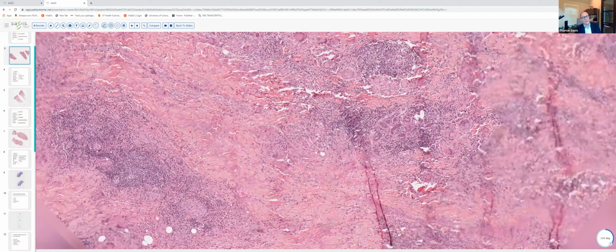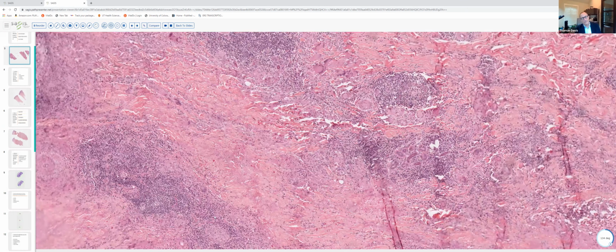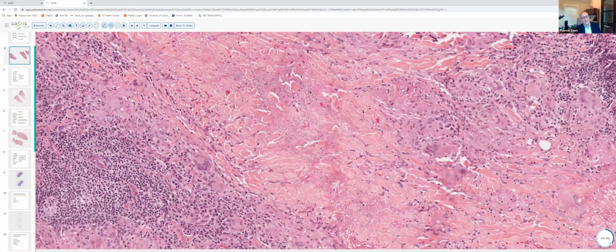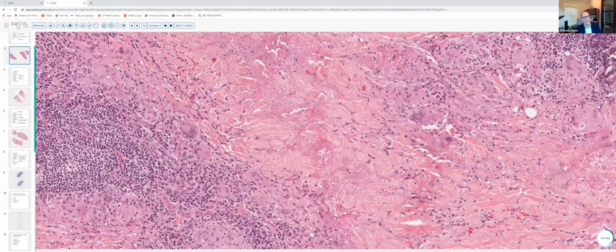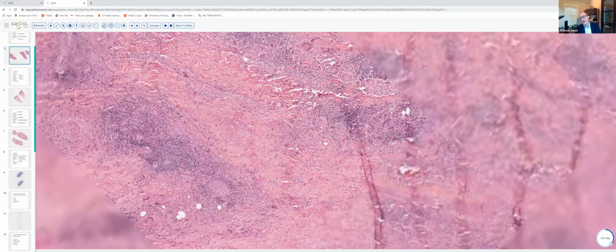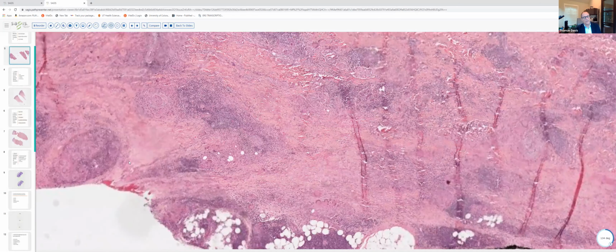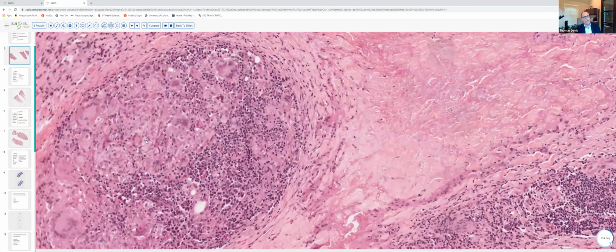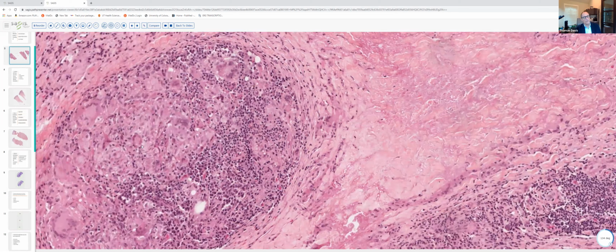These are encased at their periphery by collections of epithelioid histiocytes. And some of these epithelioid histiocytes have the appearance of foreign body giant cells. And you can see they're really large and kind of bizarre looking. They've got a huge number of nuclei in their cytoplasm. There's an accompanying infiltrate of lymphocytes and histiocytes here. And then in a few areas out at the periphery, there were no cholesterol clefts, but there were clearly some foam cells here.